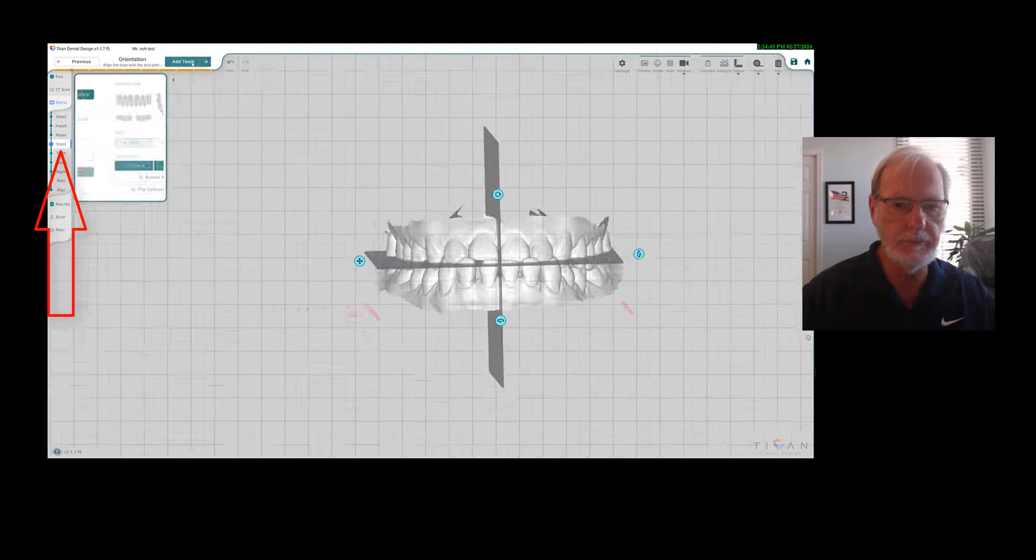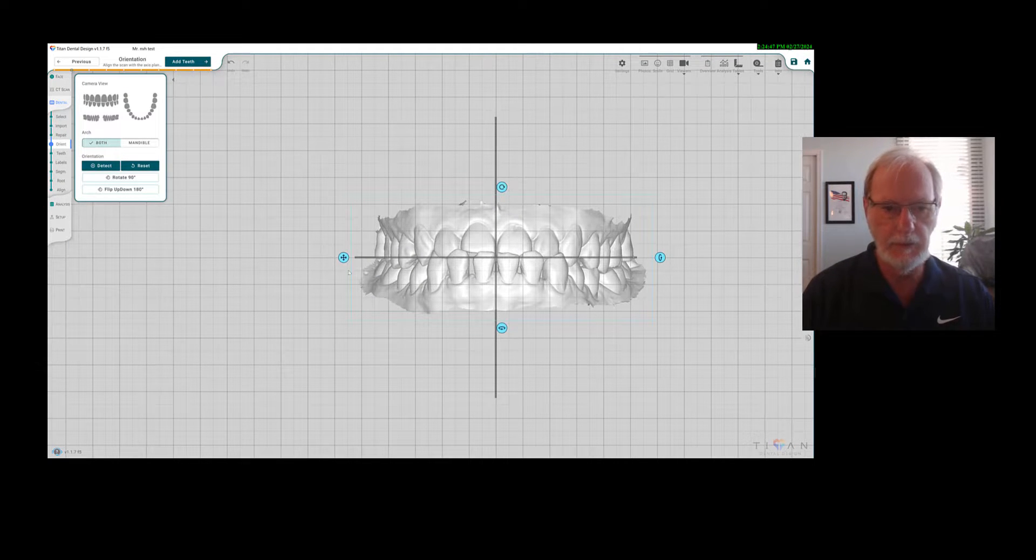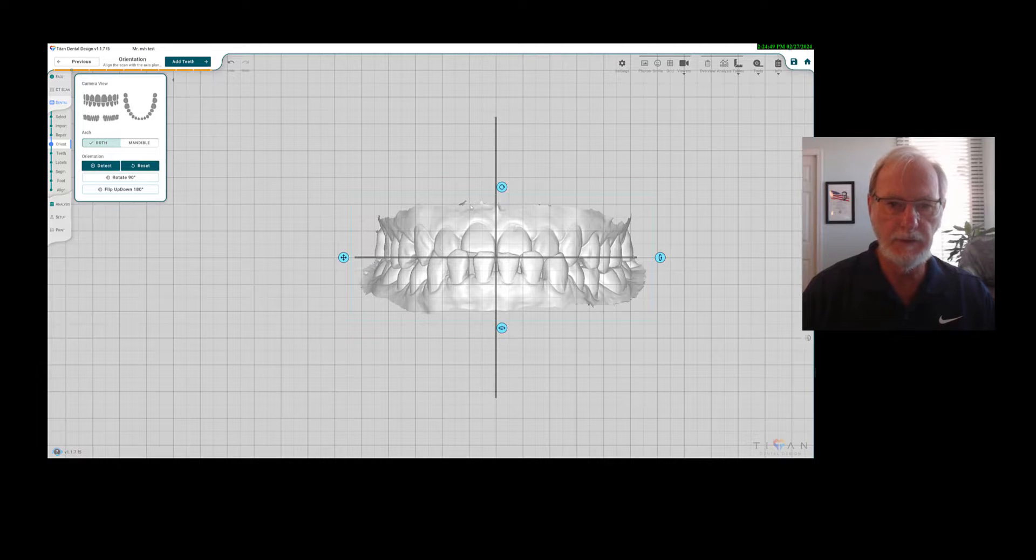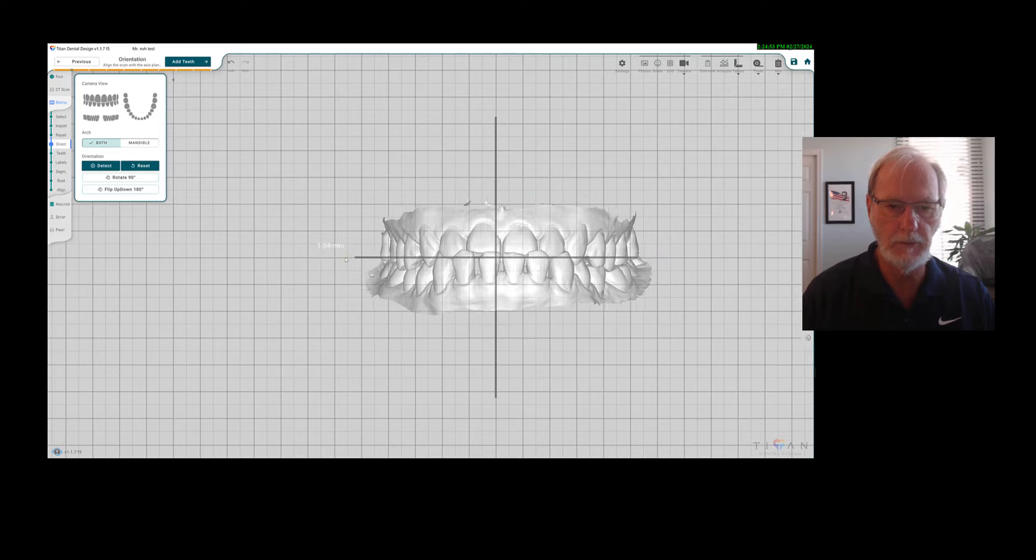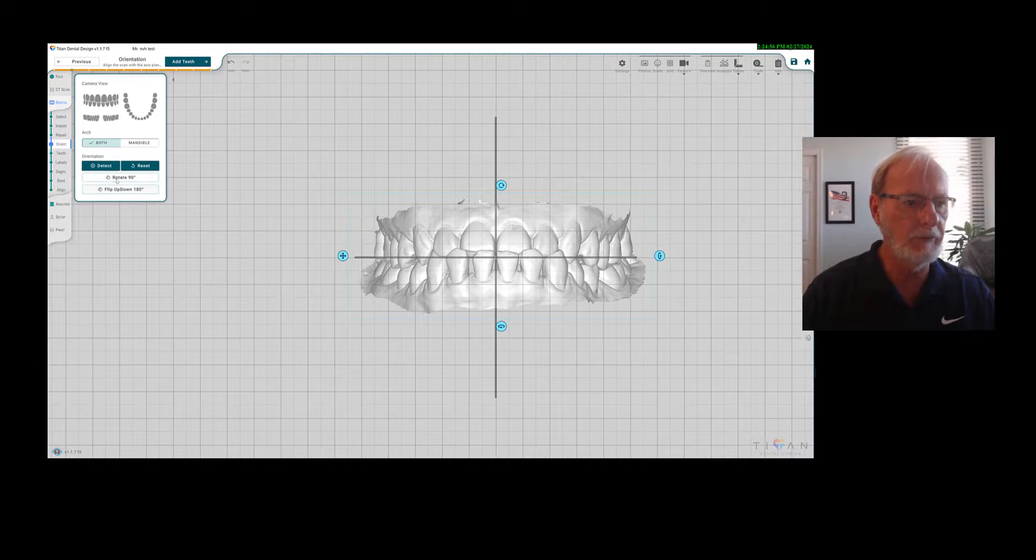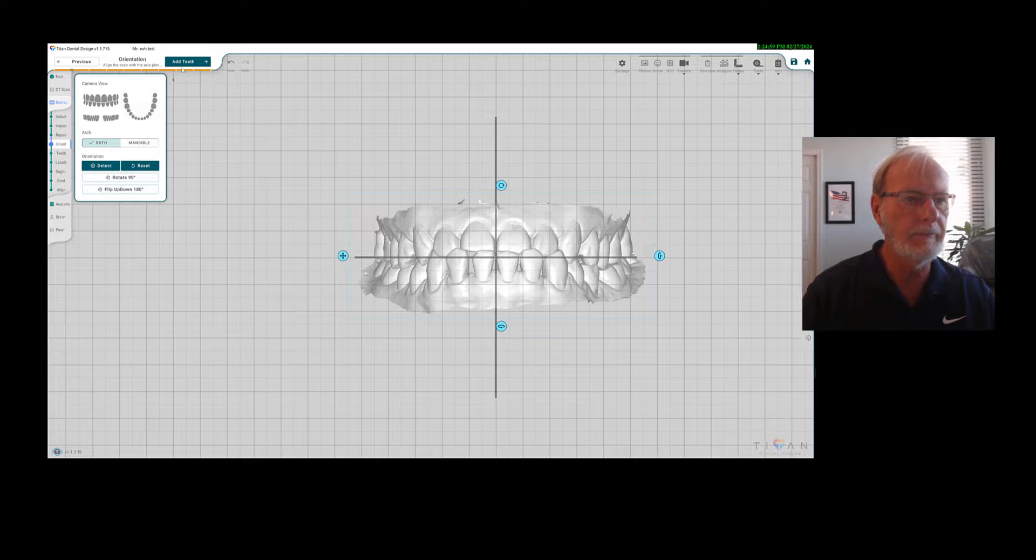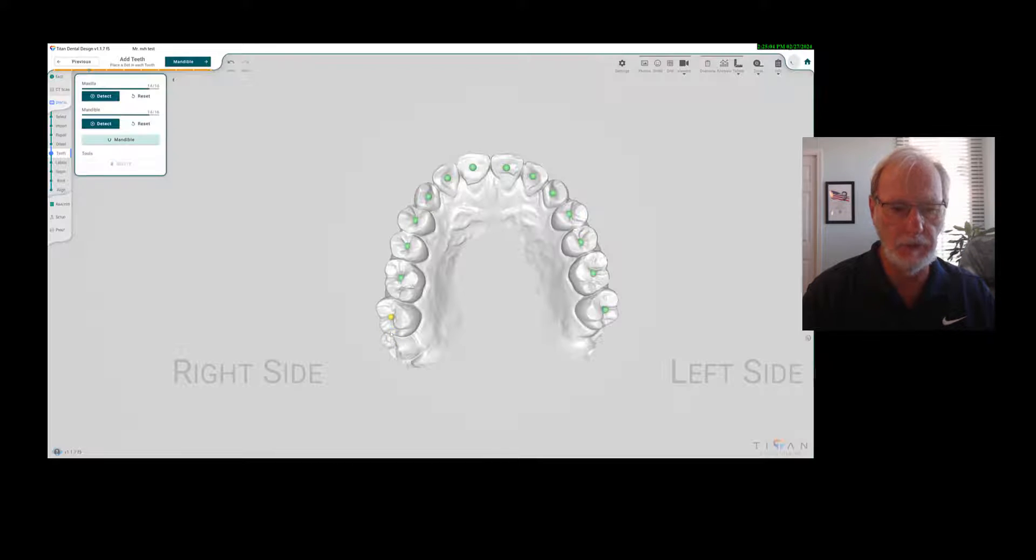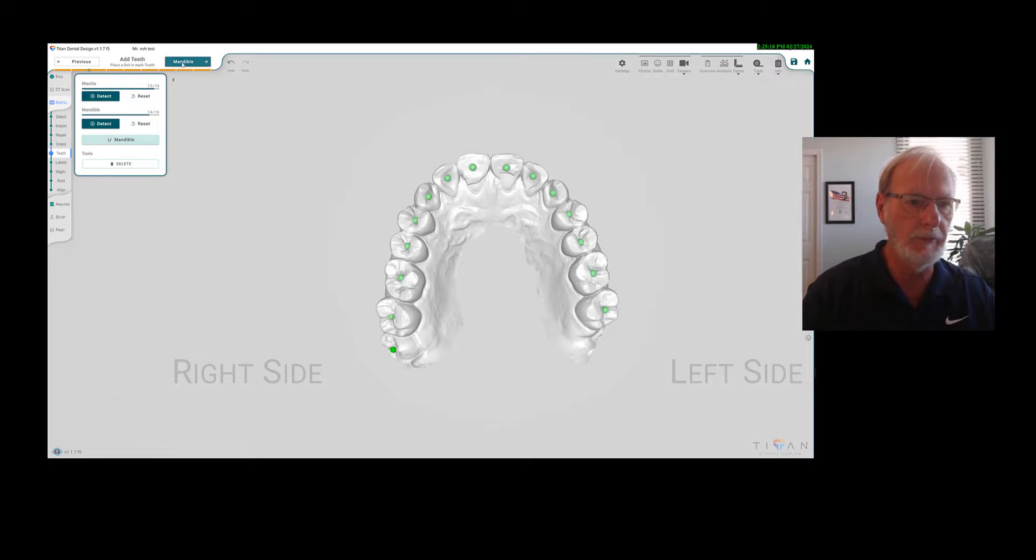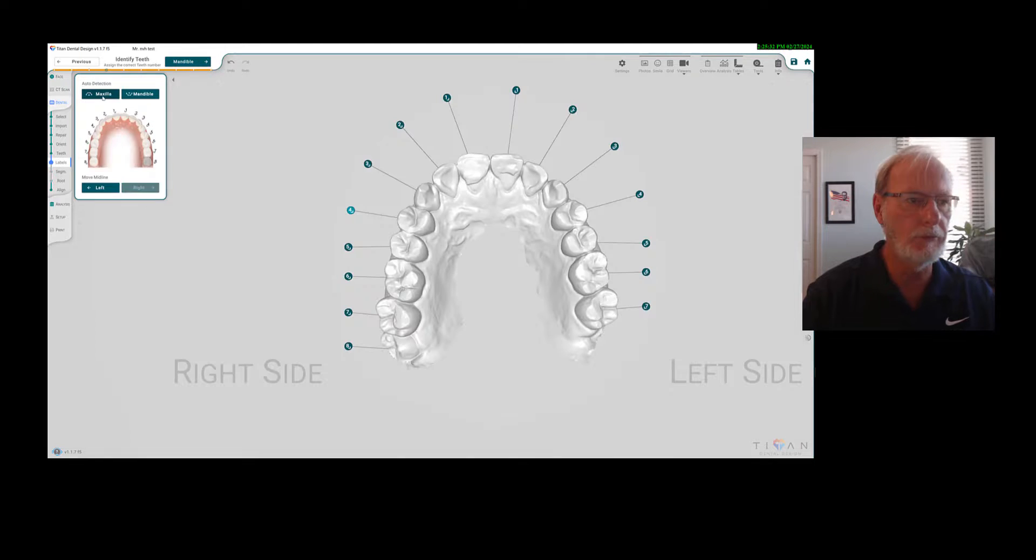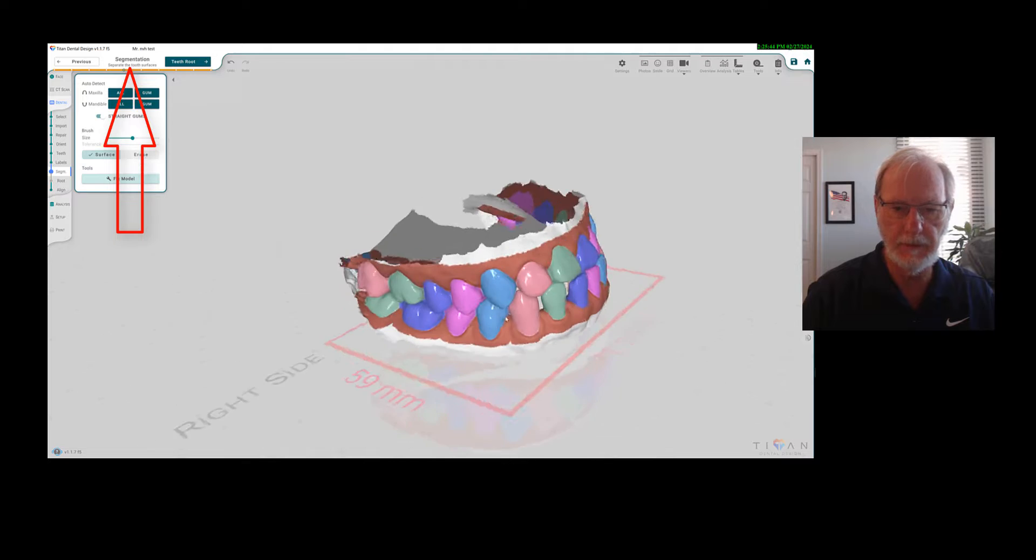You have the orientation. Again, I'm just showing you the software. These are the buttons that you can use to change the angulation. You can move right to left, so I'll let you design this. You can rotate, flip, and then you add the teeth. It's been done already, so you can add a tooth here by clicking on the little green dots. You can do the manual. You have the same thing. You can do auto detection right here, so let's do the segmentation now.